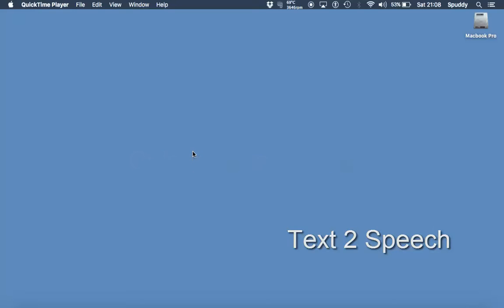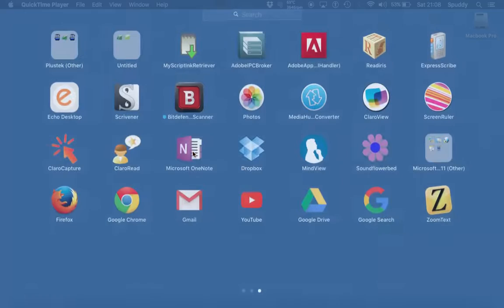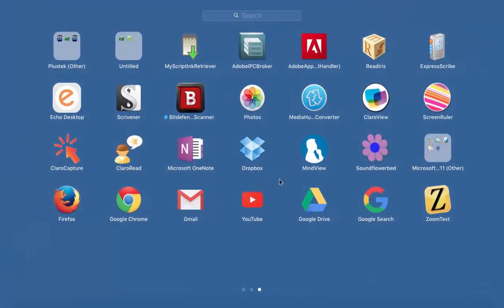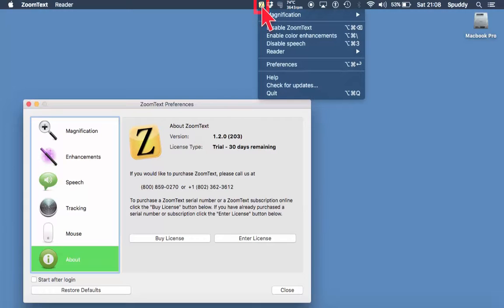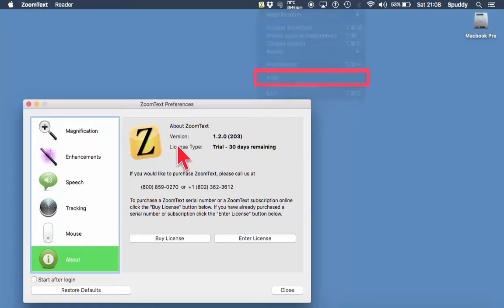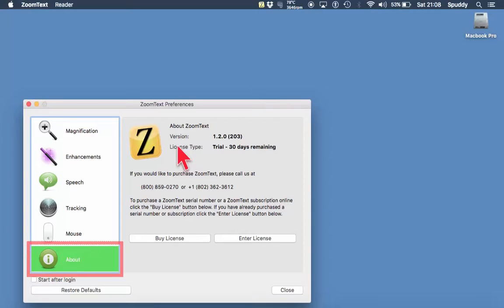Let's open up ZoomText. It shows a little icon at the top that we can access by doing a right-click on as well. So if I want to select preferences, it will bring this window up. It's only a demo version because I've just downloaded it not long ago.